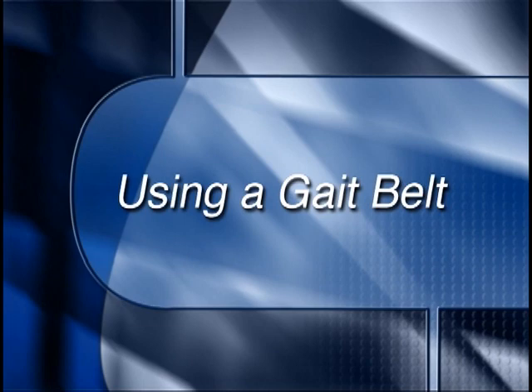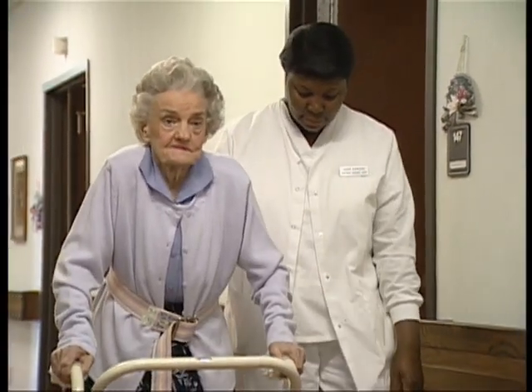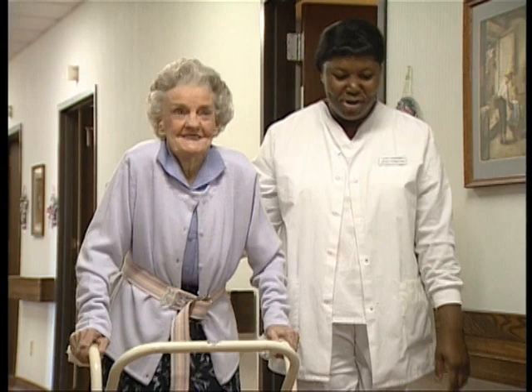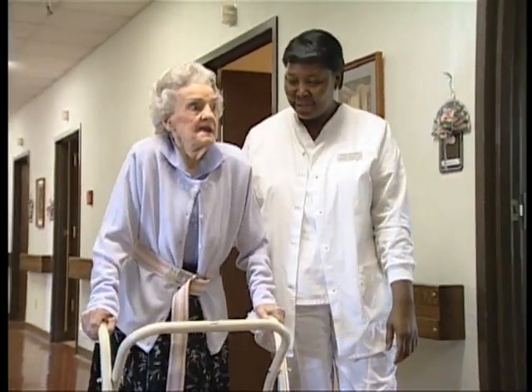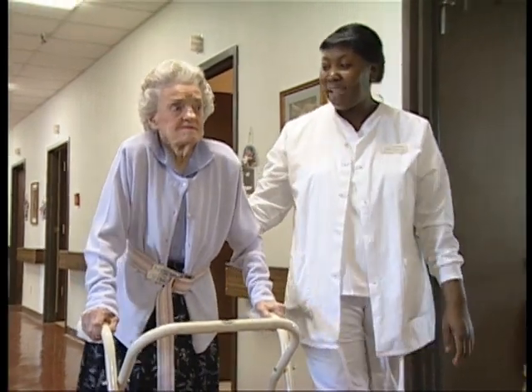Using a gait belt. The use of a gait belt can make transferring and walking a resident safer and easier for both you and the resident. It may also help ease a resident's fear of being moved. That belt means a lot, because you feel more secure when you have that around you, in case you did fall or your legs did give out, they can grab you right quick.